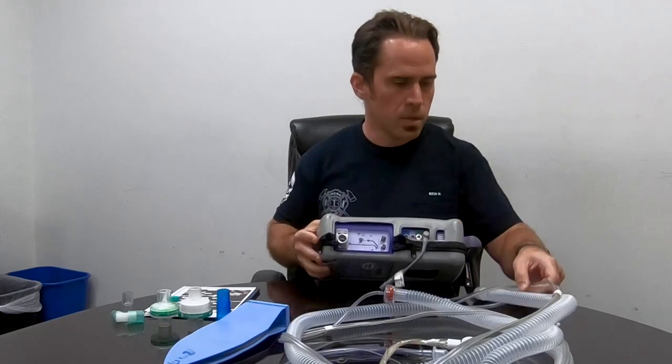Hey everyone, we're going to go over today some basic vent stuff and then I'm going to show you what I do every day to set this vent up so it's a pre-connect for you for every single adult patient you could ever have. We'll start from the beginning with the setup.